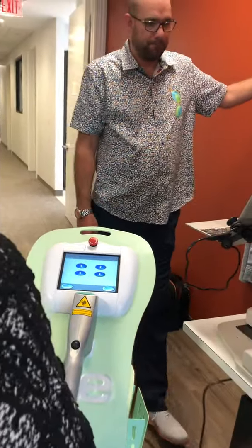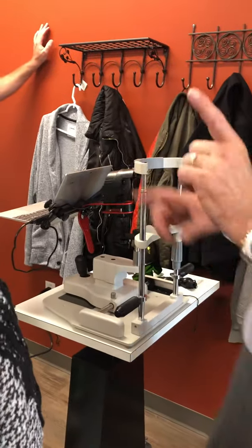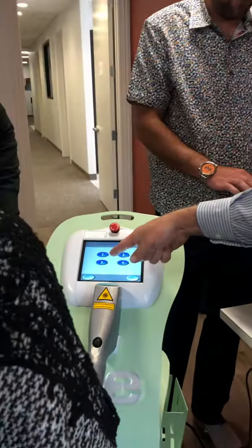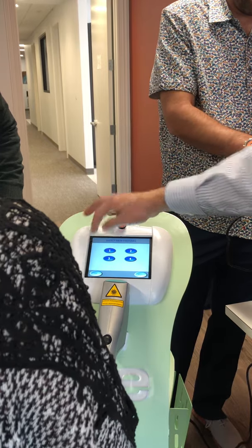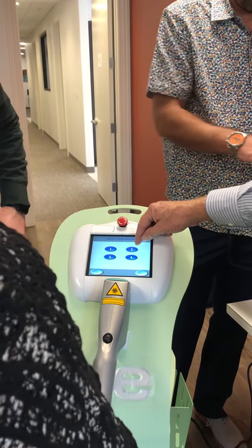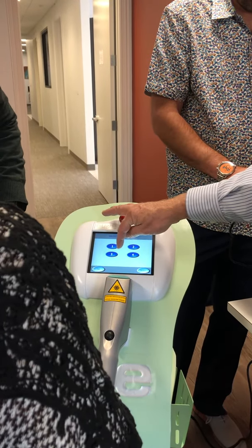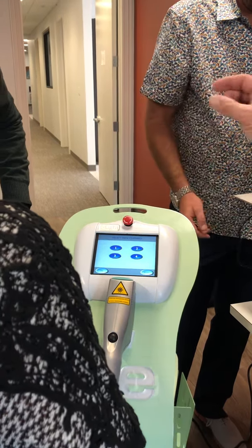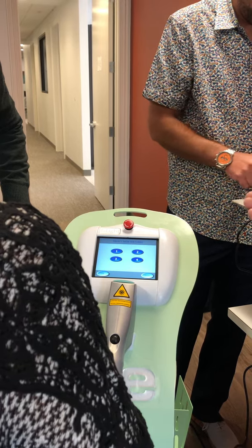What did we get? So your name? Celinda. Okay, so we're going to assume that Celinda's not telling me that she's chronic, like off the board. So somebody that's really light, we would do a 1. Somebody that's 20 or 30% of the meibomian glands are truncated or gone or skewed, we'd do a 2. Somebody that's 30, 40%, we would do a 3. And somebody that's significant truncation, 40, 50% or greater, we're going to do a 4.